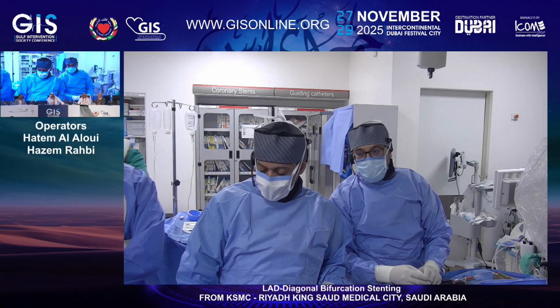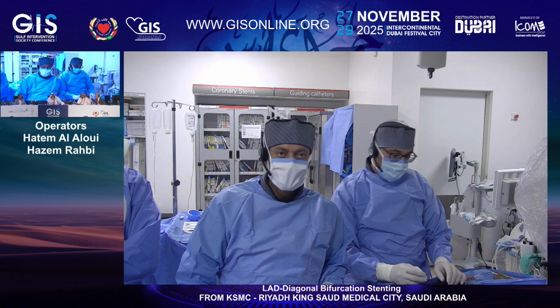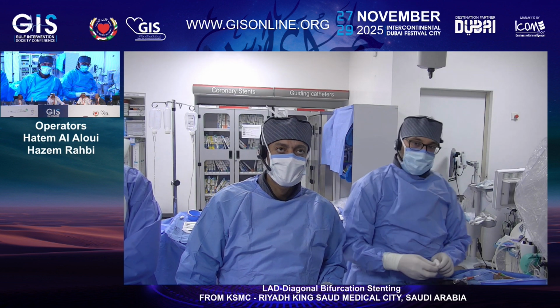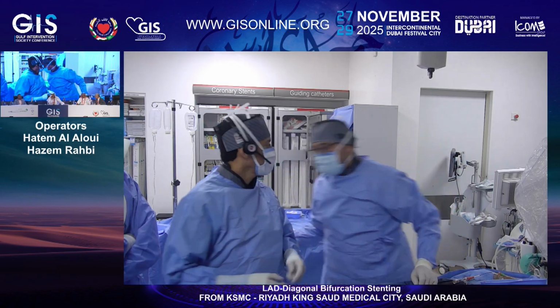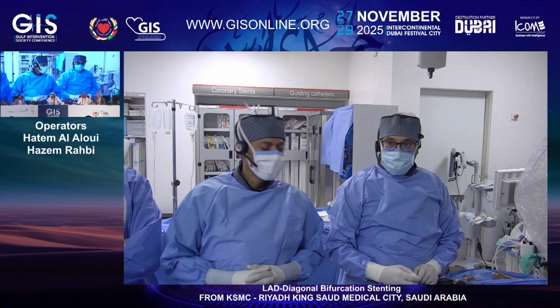Dr. Khalid, for the plan, sorry, Dr. Hatem, let me ask Dr. Khalid here. Dr. Khalid, the IVUS showed the LAD distally is around 3, proximally is around 4 or something. And the disease reaches also to the proximal LAD. And also there is the question whether to use a short stent or a long stent. How would you tackle this?